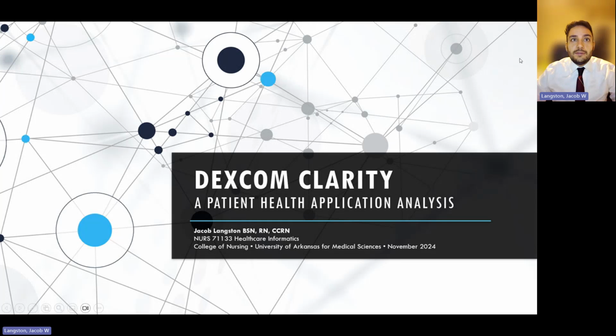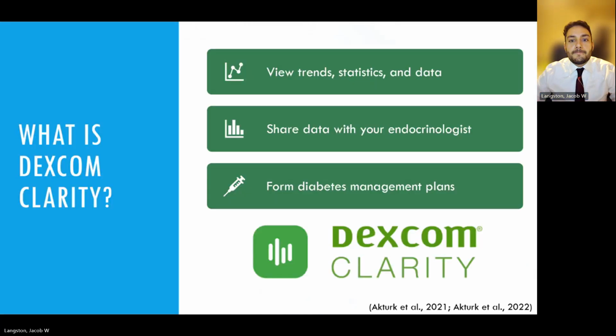We are going to analyze Dexcom Clarity. It is an application for diabetic patients. So what is Dexcom Clarity? It's an extension of the Dexcom continuous glucose management device. Clarity allows diabetics to transform data from their CGM into meaningful insights that facilitate a more proactive and personalized healthcare management. This data can be seamlessly shared with your provider, and access to these trends allow patients and the provider to work together to form diabetes management plans and fill in the gaps in their care as they become apparent.